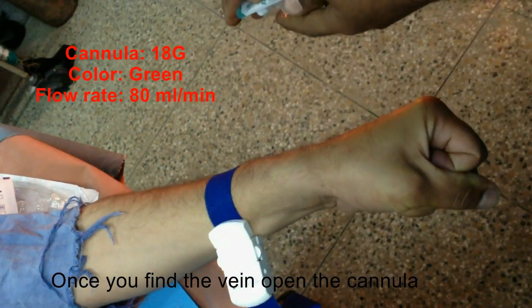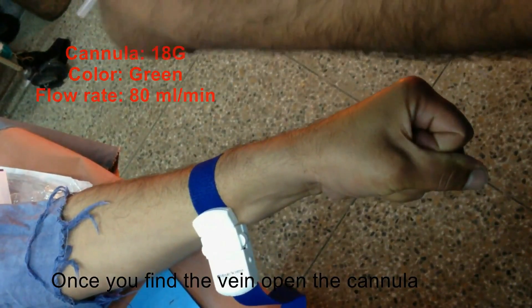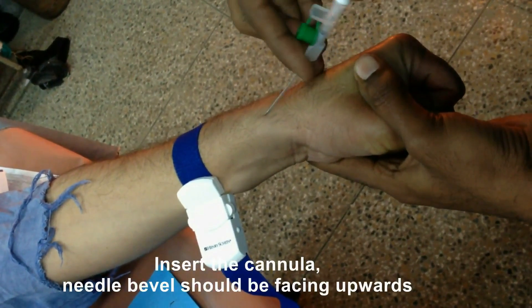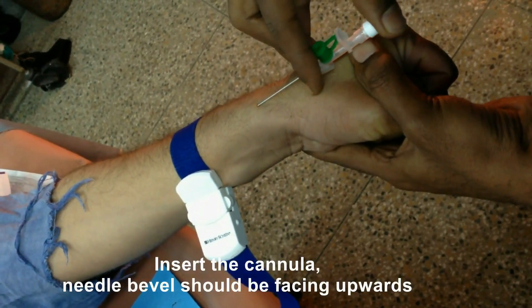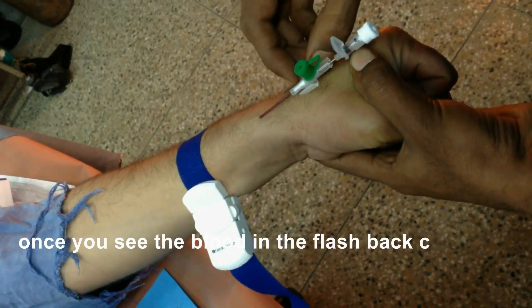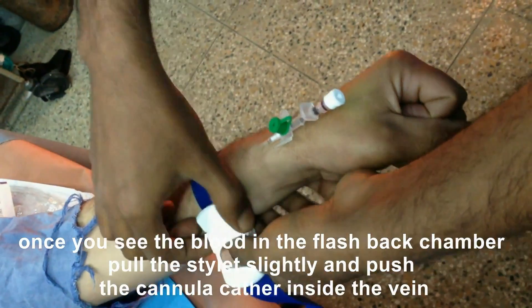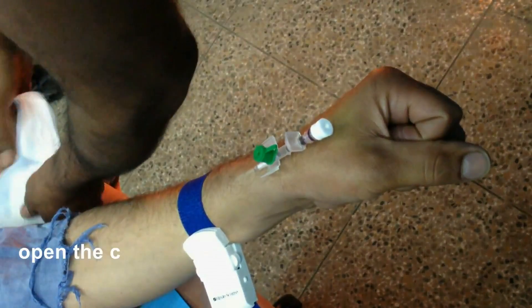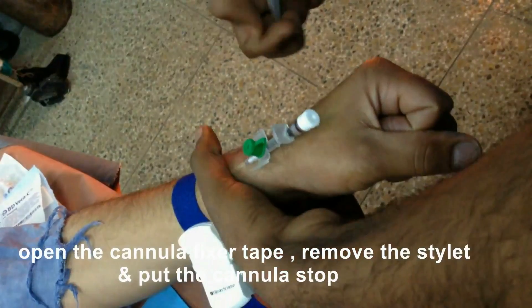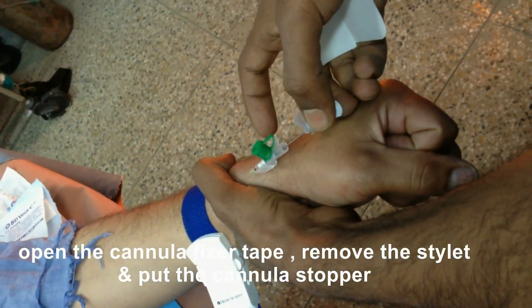I'm going to use an 18 gauge cannula. Insert the cannula slowly — make sure your needle bevel is facing upwards. Look at the blood in the flashback chamber of the cannula. Once when you see the blood in the flashback chamber, pull out the stylet slightly and push the cannula inside.